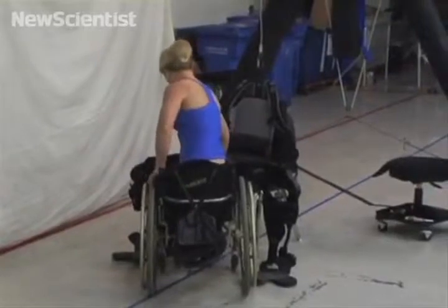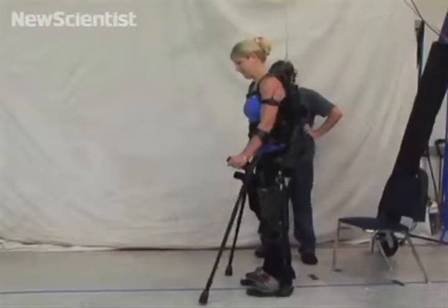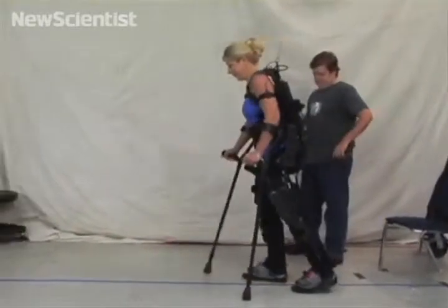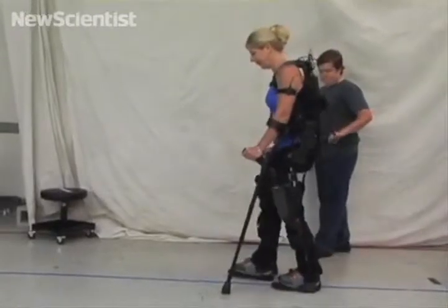Unlike previous exoskeletons, this one is easy to put on without help from others. Sensors in the crutches and armbands detect what the wearer wants to do. Pushing down on the left crutch, for example, allows the person to step with their right foot.